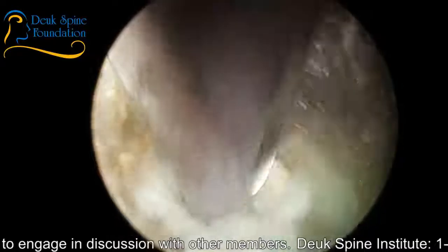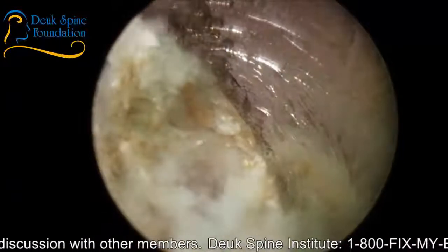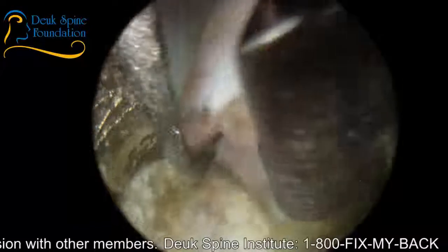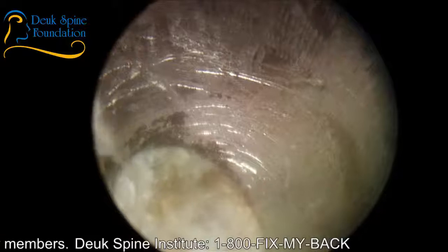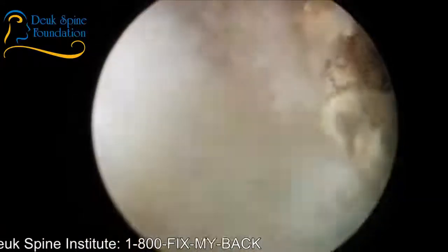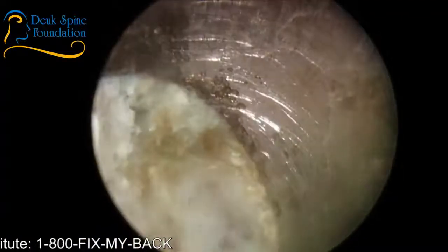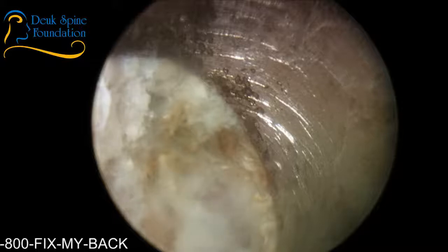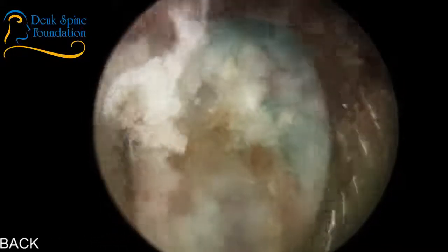Now, we are removing some bone spurs, so inevitably there's going to be some bleeding as you remove bone spurs, because bone spurs are basically outgrowths of bone, and the center of the bone spur many times has bone marrow inside it, and they bleed. Even though they're just bone spurs, they'll bleed as you remove them.